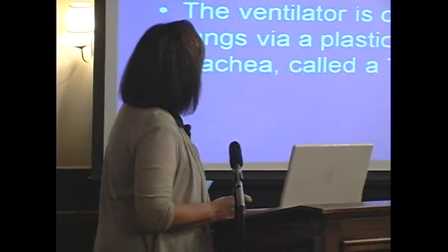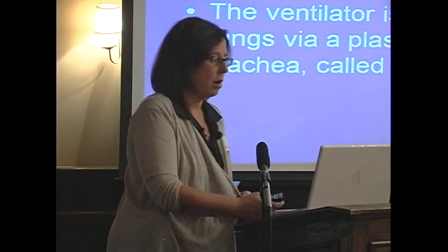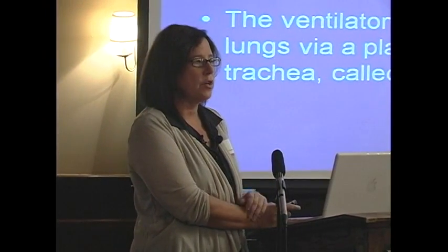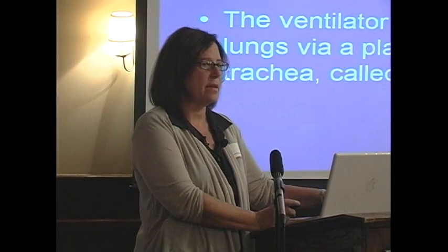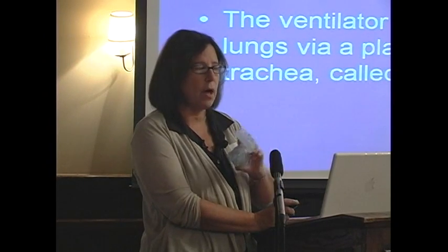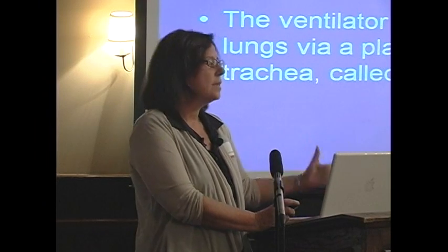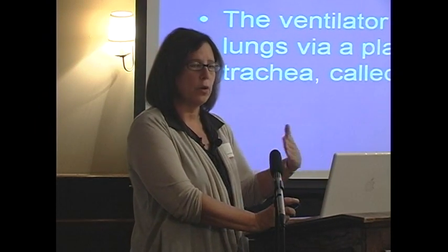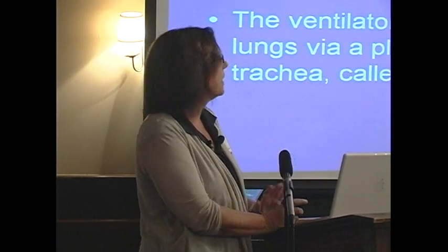Okay. So moving on to ventilators, which are different than BiPAP. We consider BiPAP non-invasive ventilation, and we say non-invasive because these masks are considered non-invasive. They can be taken on and off. People can speak, they can eat. A ventilator is sort of another step up. They're more invasive and more technologically sophisticated.